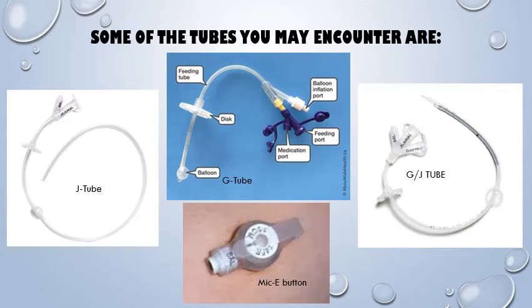This surgery is performed in a hospital operating room with the individual under anesthesia. The surgical gastrojejunostomy tube has a port for direct feeding into the small bowel and a separate port for access simultaneously to the stomach. There will be a specific order for supplement, medication, and water for the G port and J port.